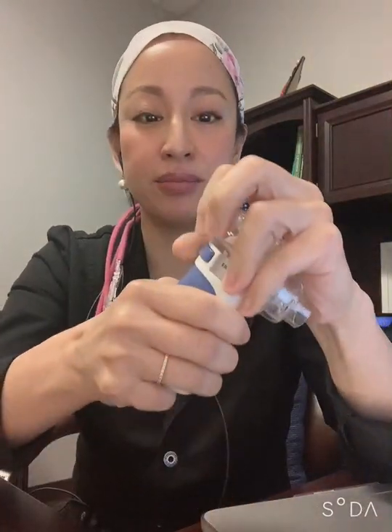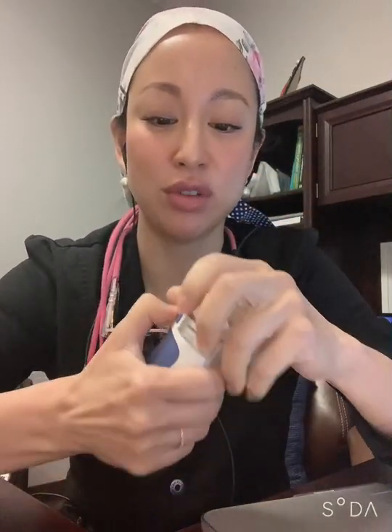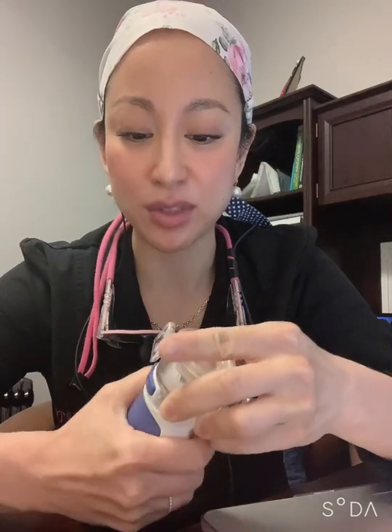The other issue that I have had with this is that it is very difficult to disengage, especially with liquid in it. So make sure you don't have liquid in it, because it might leak out. The other issue I think Lily was saying that she was having is leakage, and I'm not quite sure.